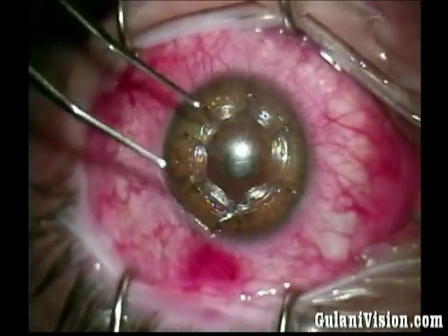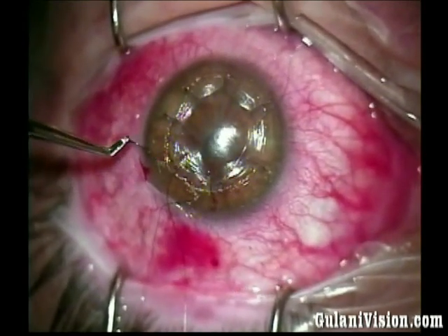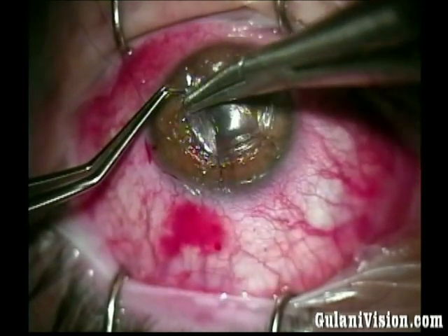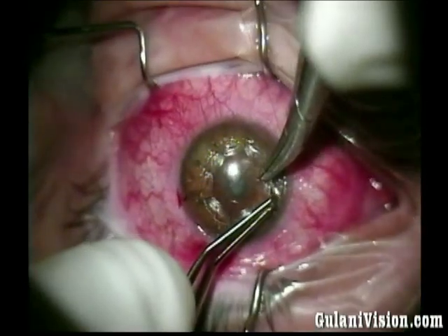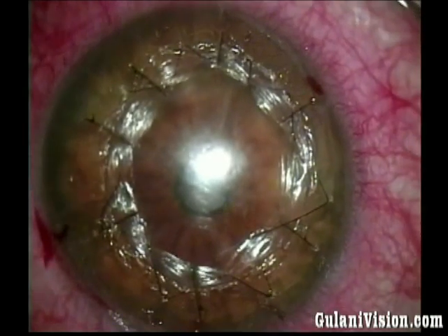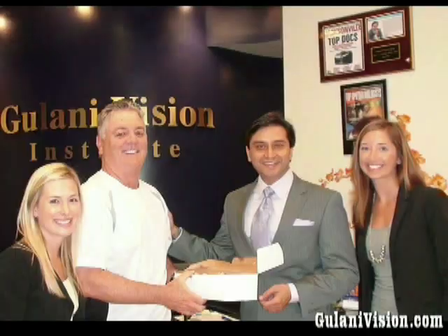I'm now starting my anti-torque 8-bite suture, gently, one at a time, across the incisions on both ends, using my instruments for counter pressure, as you can see here, gently buttressing the RK incisions in the radial pattern too. And here is the endpoint. Case complete. This dentist brings donuts to show his appreciation.